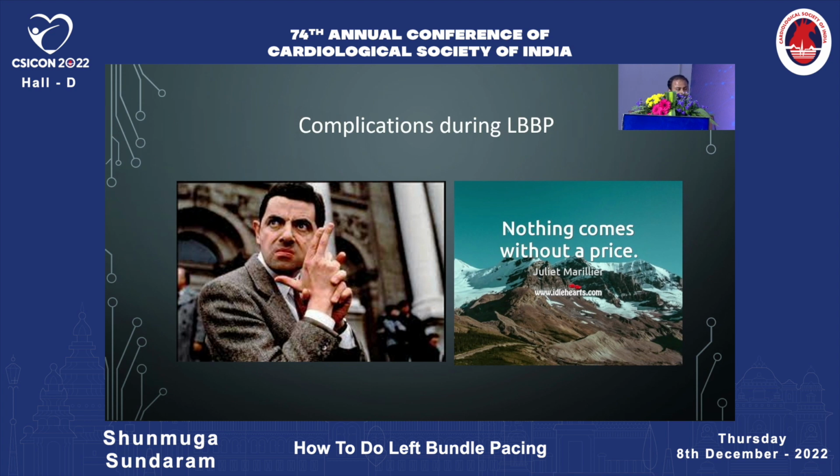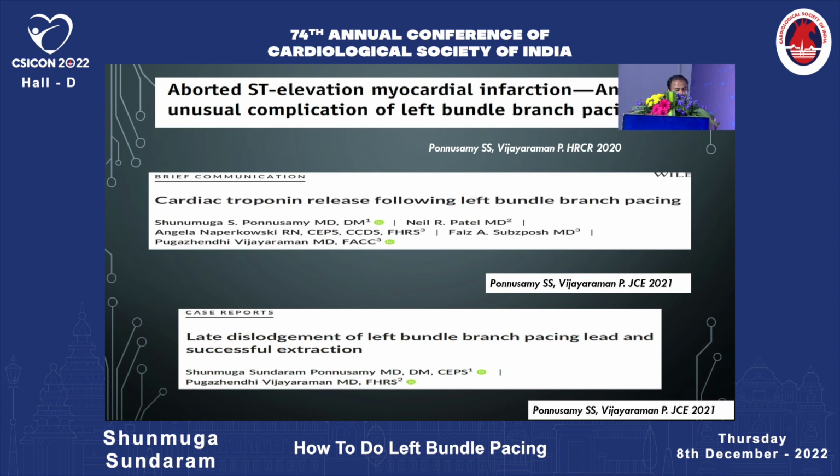But we know that nothing in medicine comes for free. We have complications. We have aborted STEMI during the procedure, which you have to stop immediately and look for the cause, or sometimes the troponin release may be quite significant. But what we documented was we compared the troponin release in patients undergoing ablations for SVT as well as left bundle branch pacing. What we could find out was the troponin release was less than that released during SVT ablation.